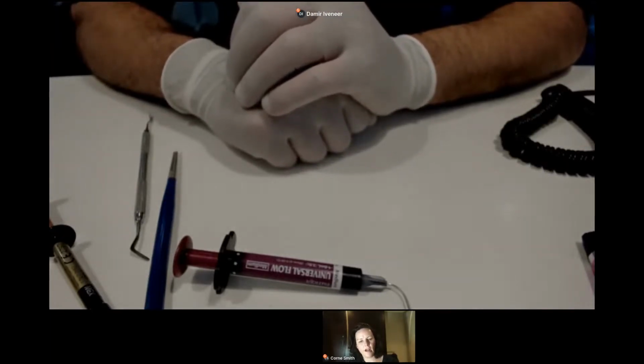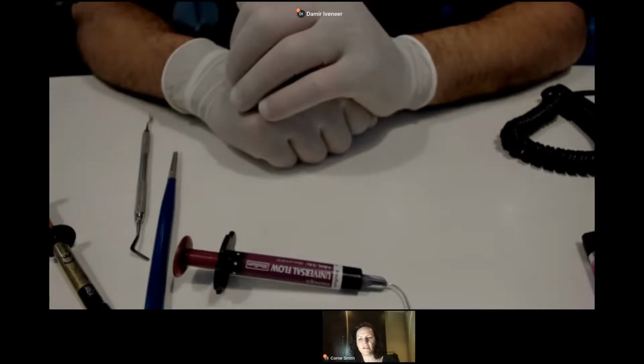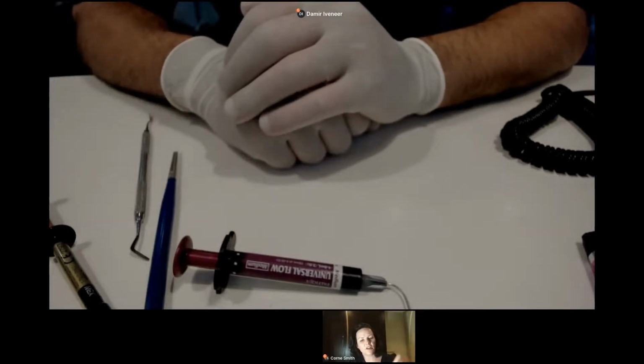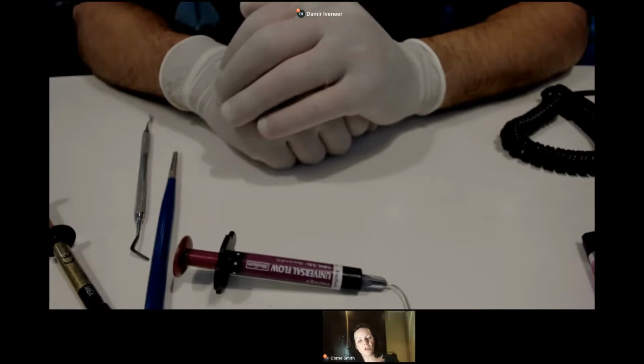Yeah, I agree. And I think with any sort of injection molding technique, interproximal finishing is probably the area that's the most difficult to manage. But what I actually found, which was for me one of the greatest advantages of iVeneer versus conventional injection molding, is that I got a really nice smooth finish already with the matrix. With injection molding, sometimes there's so much excess that you need to clean up interproximally, even just a little bit of excess, which makes it much more difficult to clean and to finish interproximally. But I agree with you.